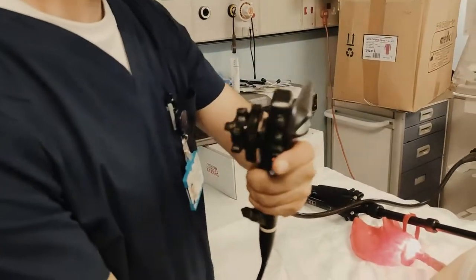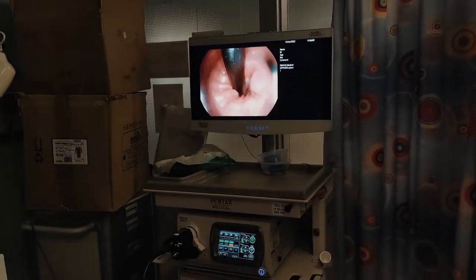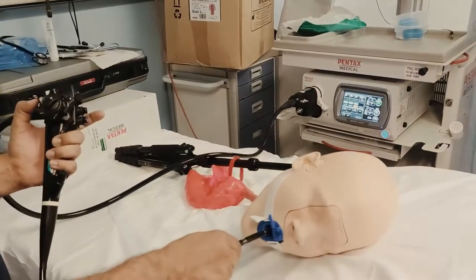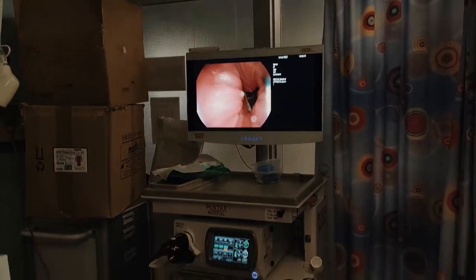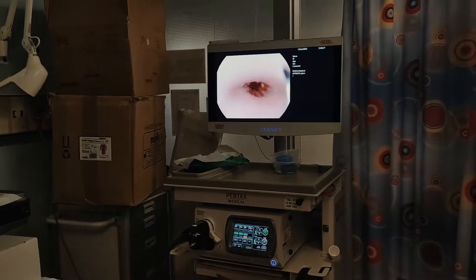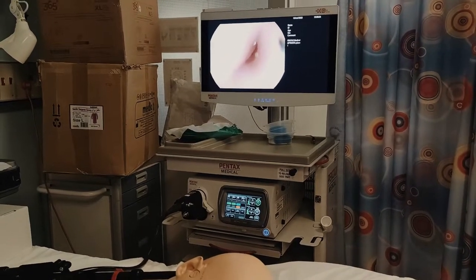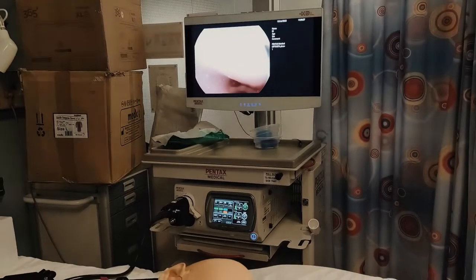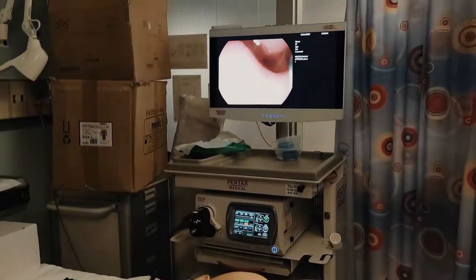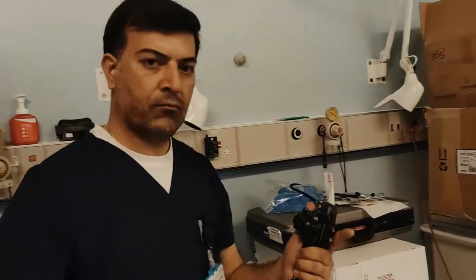Dr. Havari has just shown us a 360-degree movement — he's doing it with his hand at the level of the wrist. That's a very important manoeuvre for OGDs. Now he's going to straighten the scope. In endoscopy we look at everything carefully on the way back — he just has to make sure everything's in the centre, slowly pulling back, and we can see we're back into the esophagus, having a good look at everything and making sure it's straight. Visualisation is very important on the way back, and we're back at the level of the vocal cords. That is an endoscopy without duodenal intubation.